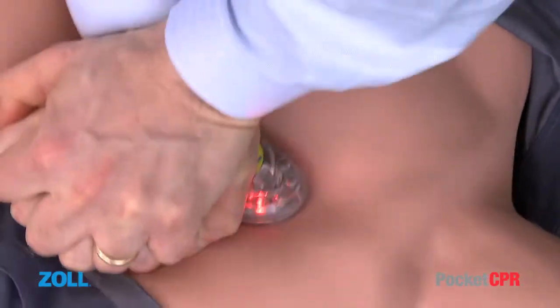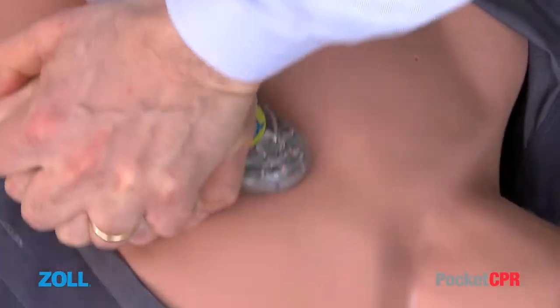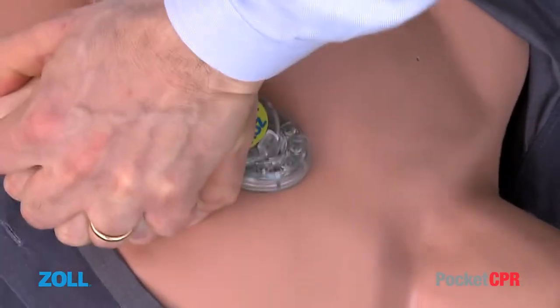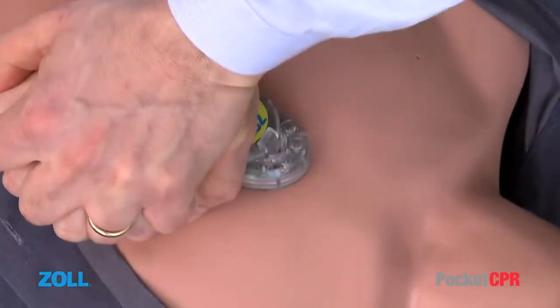Open airway. Give 2 breaths. If the user continues to do adequate chest compressions throughout the open airway give 2 breaths message, after playing the message, the device will again revert to CPR mode with flashing LEDs and voice feedback on compression depth. Good compressions.